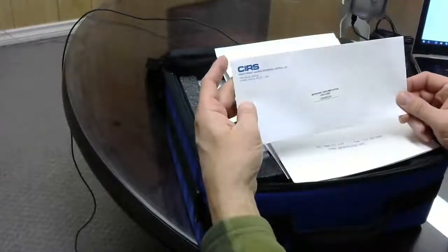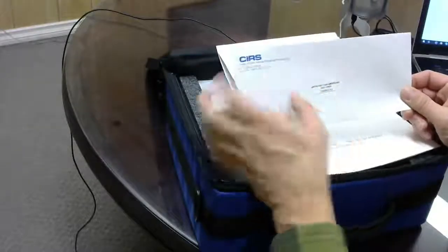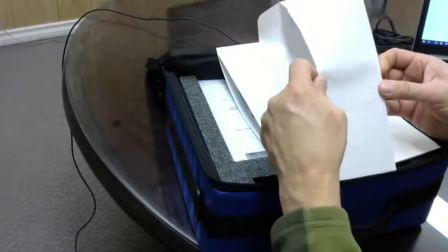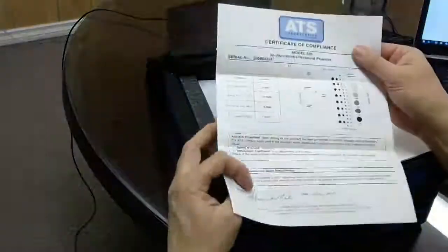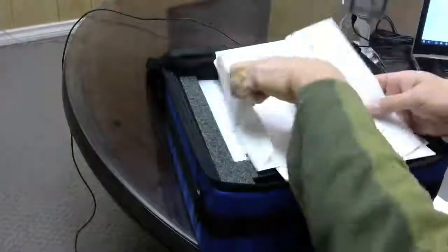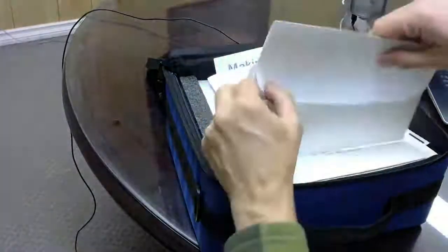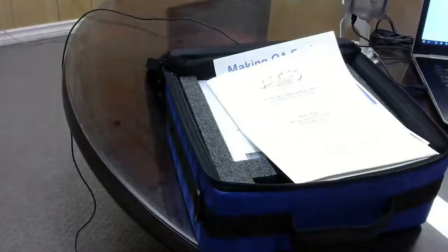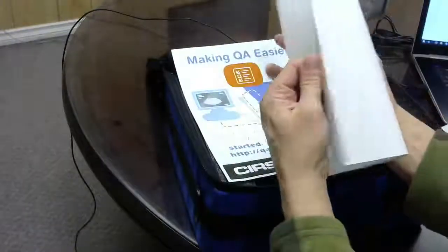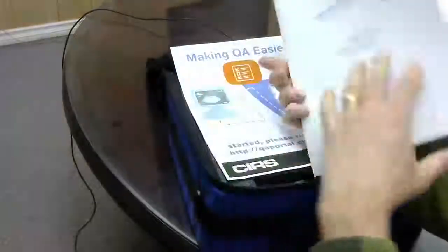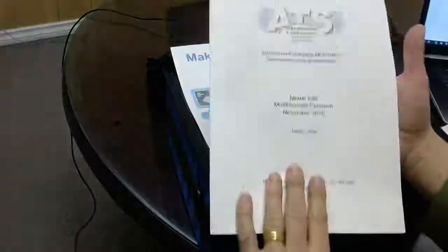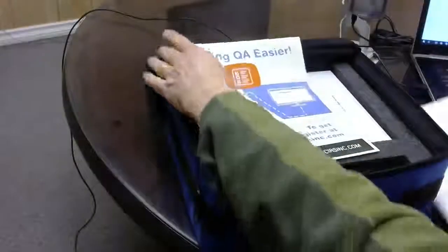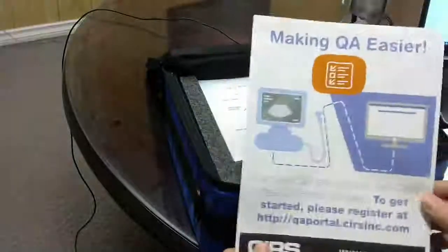The documentation is enclosed here. You'll see the certificate of compliance. You also have the instruction manual, of course, which is this nice printed instruction manual. It takes you through all the different parts of the phantom.